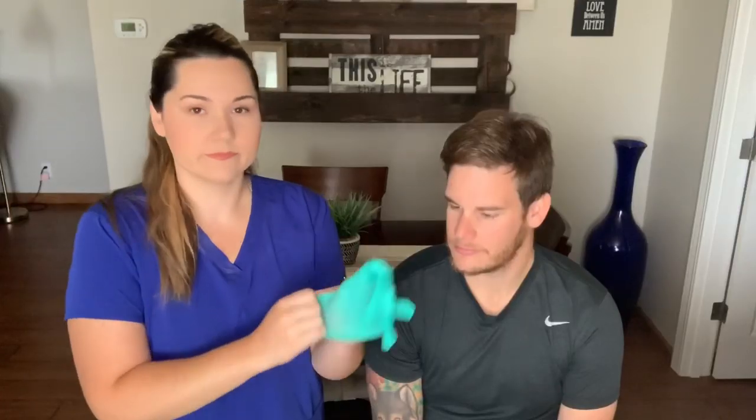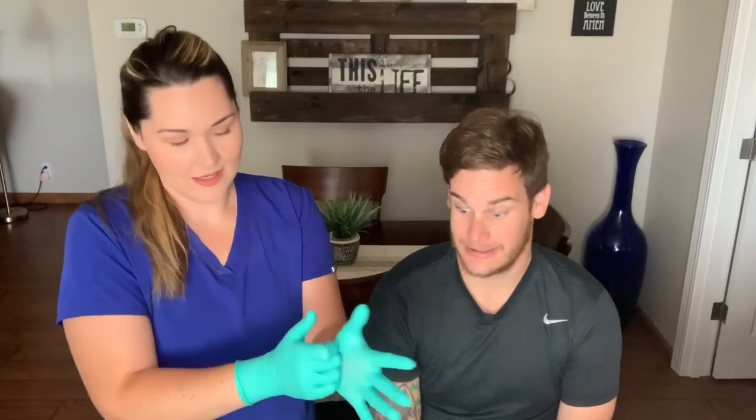All right, so we're back — it's impression time! My husband here is going to be my patient, and hopefully he's not going to throw up on me, which does happen.